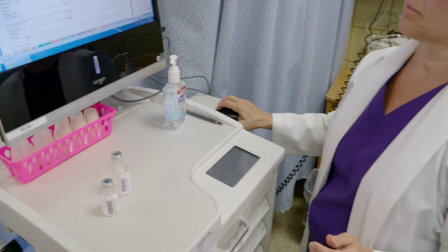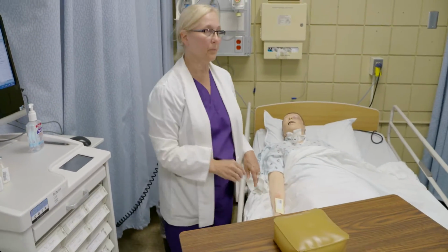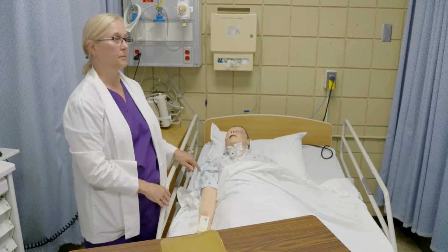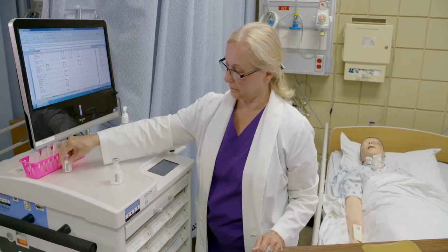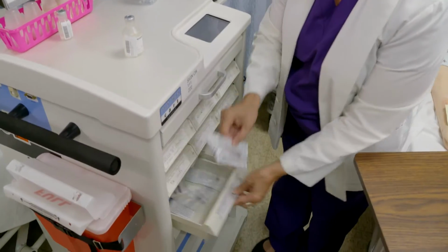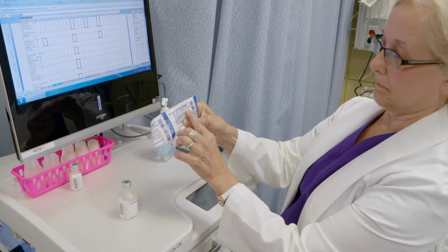Explain to the patient that they have their Procrit injection. You may ask them where they would like the injection or where they had it the previous time. This patient would prefer the injection in the abdomen. So we'll prepare the medication using a 25 to 27 gauge needle, 5/8 to 1 inch.